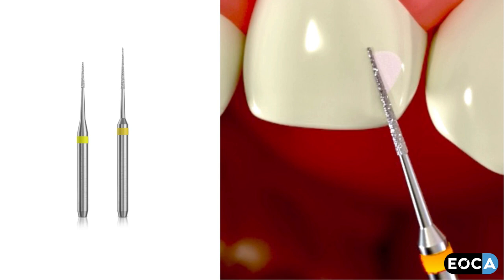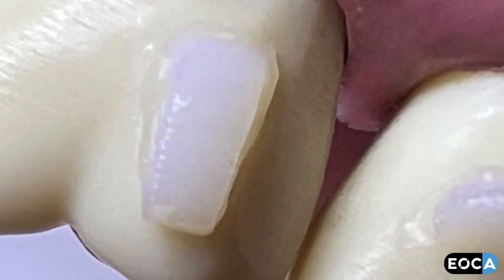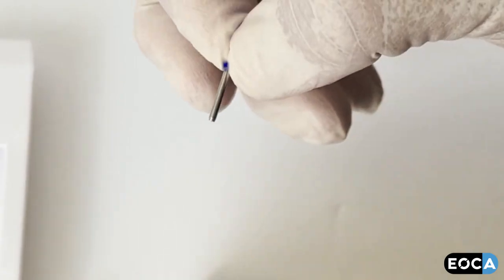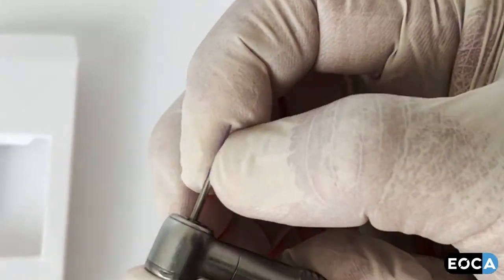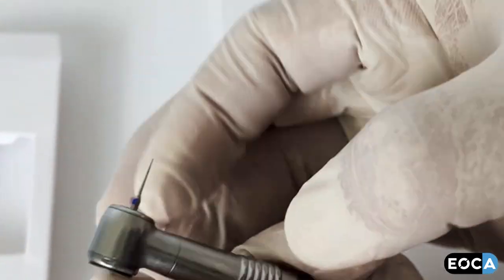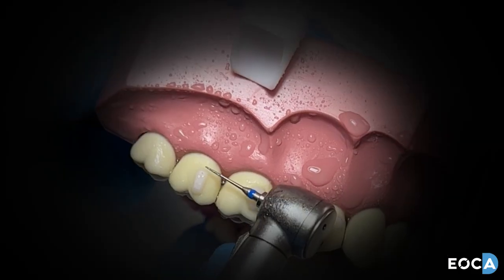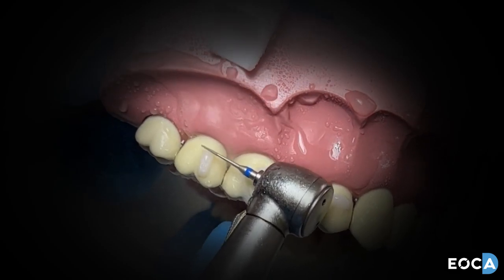To use the burrs for trimming and finishing attachments after they have been placed and fully cured, identify any excess by visual inspection or by the use of an ultraviolet LED. Remove a blue band burr from the package with tweezers and place into a high-speed turbine using finger pressure only. Select the size that allows the easiest access and maximum control, then gently wipe away the excess composite, trying to avoid touching the body of the attachment.